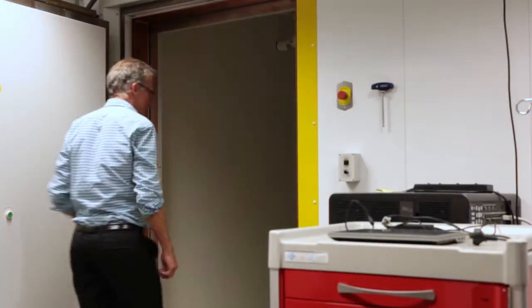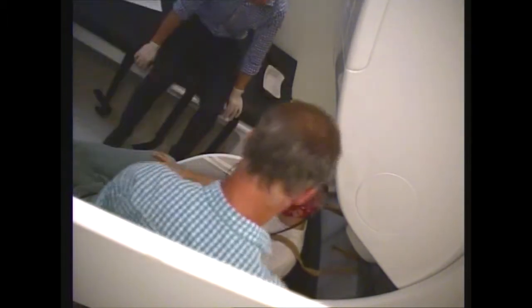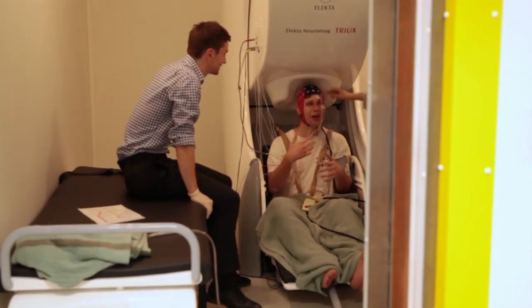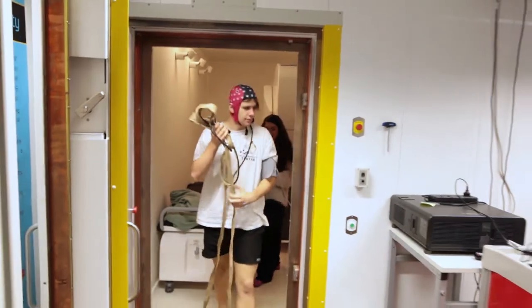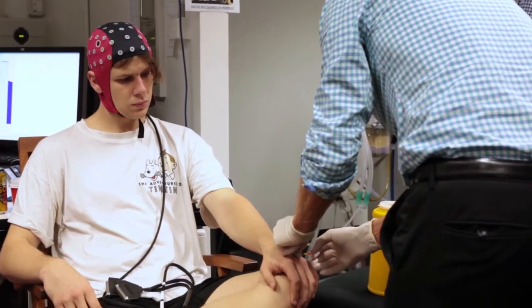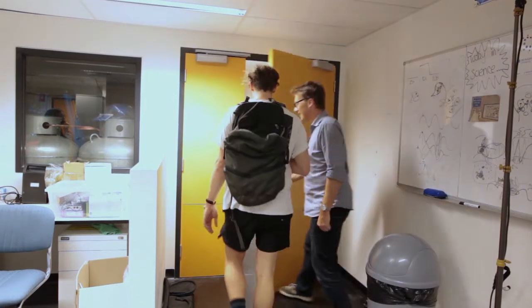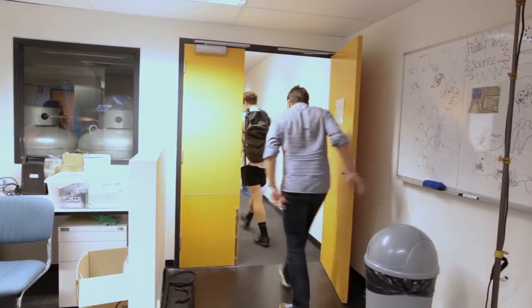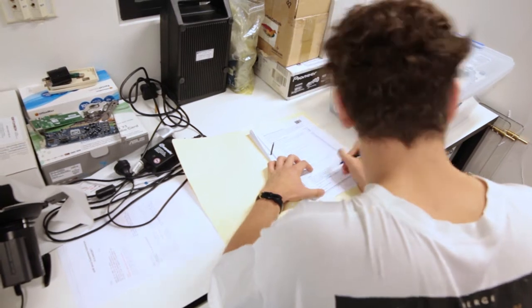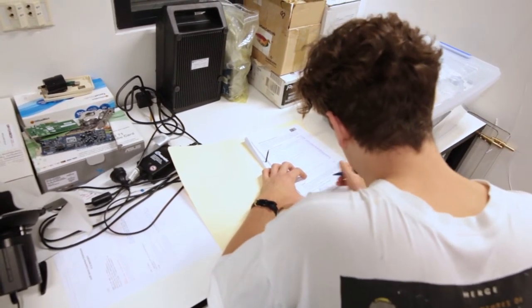At the conclusion of the experiment, the physician anesthesiologist will enter the MSR and debrief with the patient. The participant is then brought outside the MSR, where the apparatus is removed and they are administered standard post-operative anesthetic care. Before the participant leaves, ensure they are safe to travel home with a relative or friend. In the next 24 hours, the participant will be required to fill in the questionnaires regarding the procedure and any after effects.